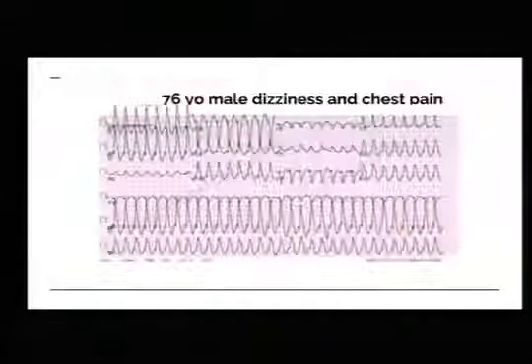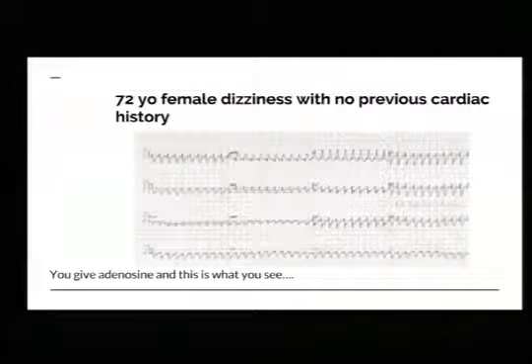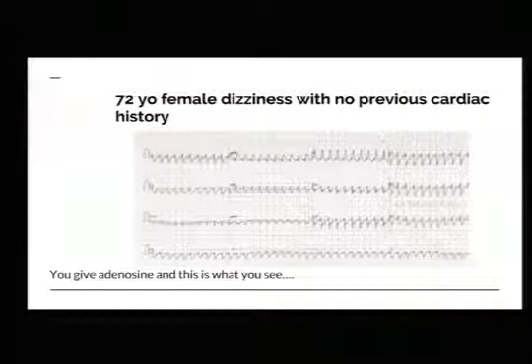So when she was, back here, she's probably a 1-to-1 flutter. So just something to think about after doing this for a long time. Old people with SVT who have never had, they don't say I've been ablated 5 times, I'm on cardiac drugs for my rate control, I've been on verapamil and all the other antiarrhythmics. A new onset 60, 70, 80-year-old with SVT looking EKG, you can give adenosine, you're not going to hurt them.